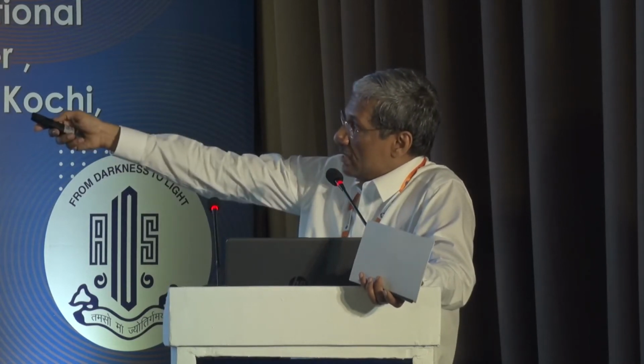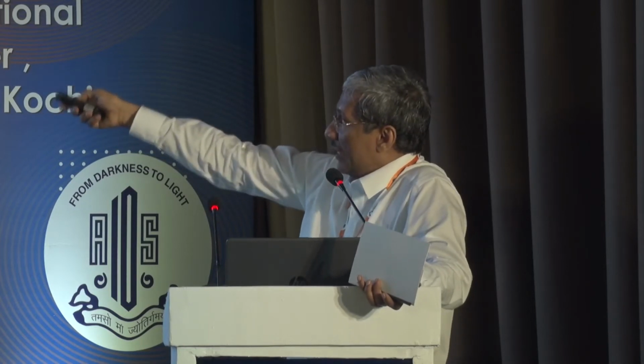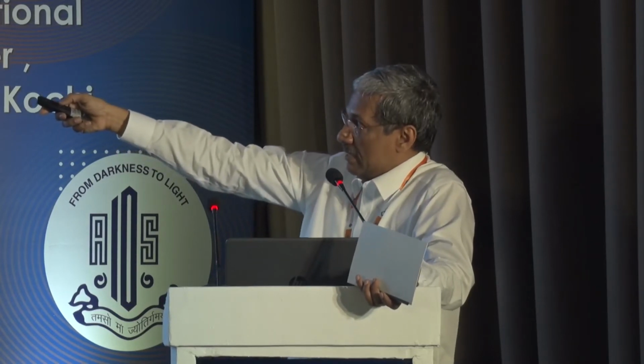So here's one more patient. You can see on the left-hand side is a central topo. On the right is a full-fledged topo that we are used to. Again, another pellucid marginal degeneration. It shows up there in not being that regular. There is an irregular astigmatism and a skewing, which you can see in the central topo.